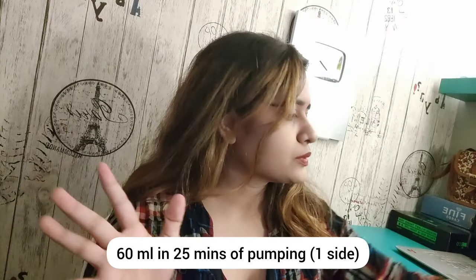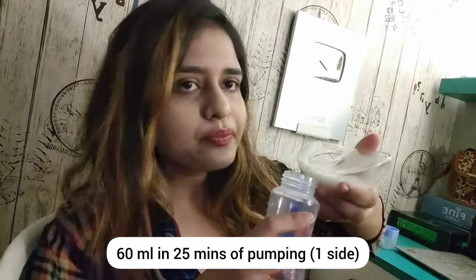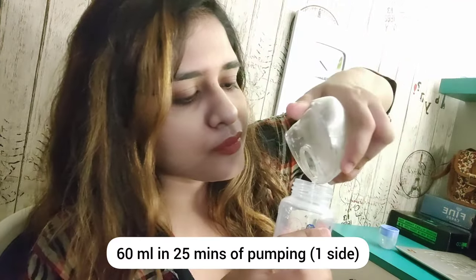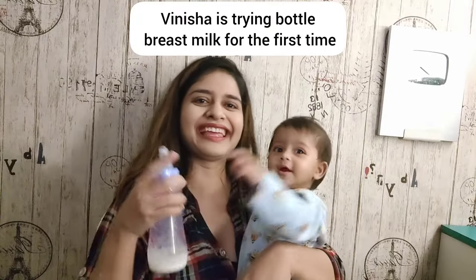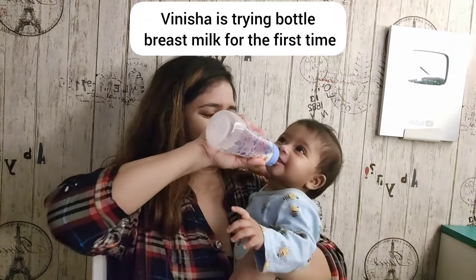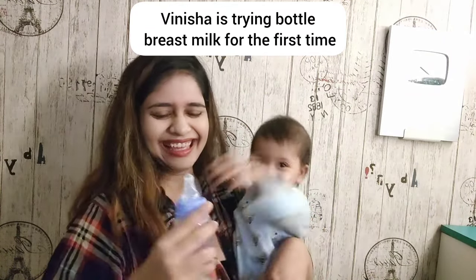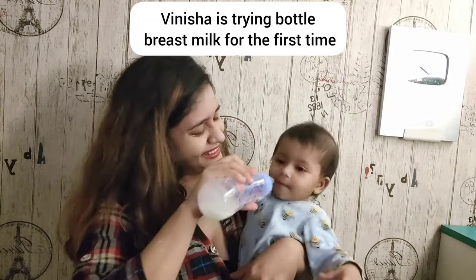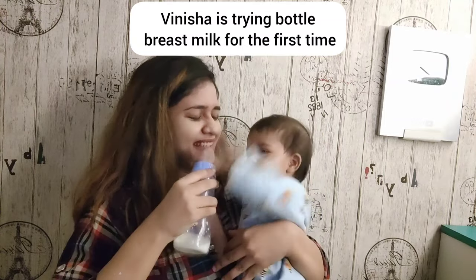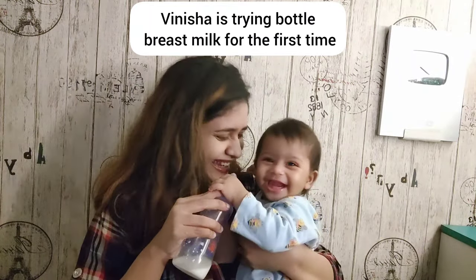Let me show you what the result is right now. Oh my God — look at the quantity collected!